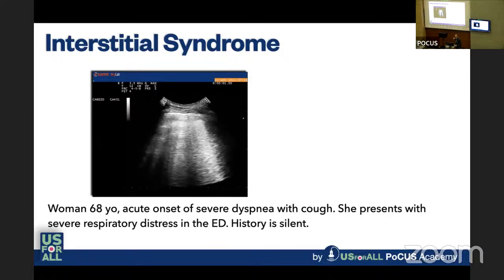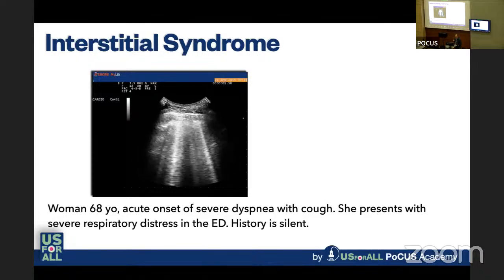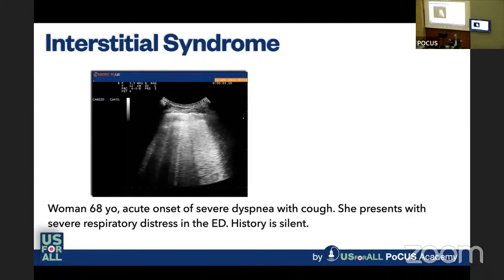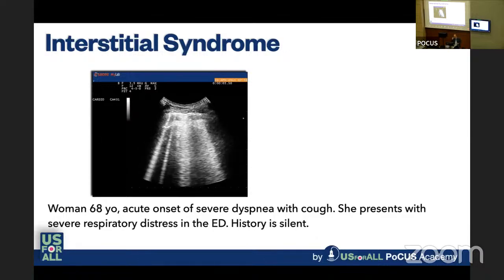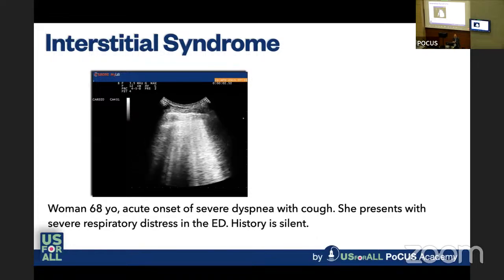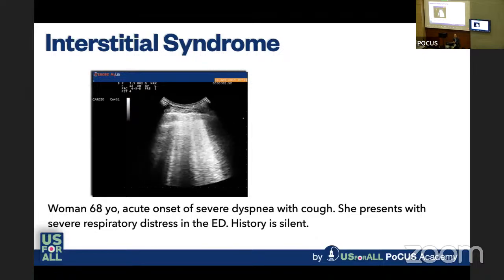So now we have here in this case, in this patient, as you can see here, you can read the condition of the patient. We see the examination of the lung with many B-lines everywhere, but we need other additional information to understand if this patient has pulmonary congestion due to cardiogenic failure, or the origin of B-lines is another one.